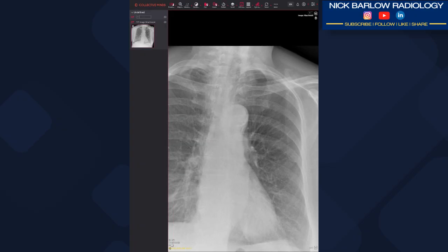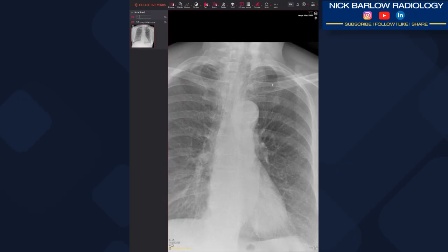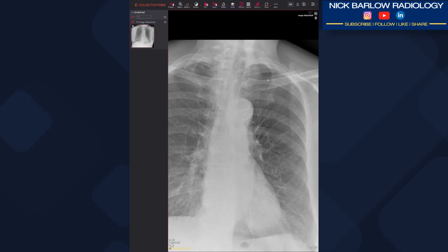I've seen quite a few cases where nodules have hidden underneath the first anterior ribs. So in this case it would be sensible to do an apical lordotic projection in order to throw the ribs off the area and be able to accurately evaluate it and exclude a lung nodule.